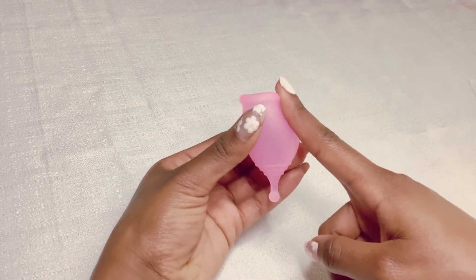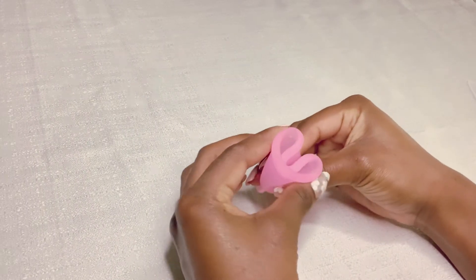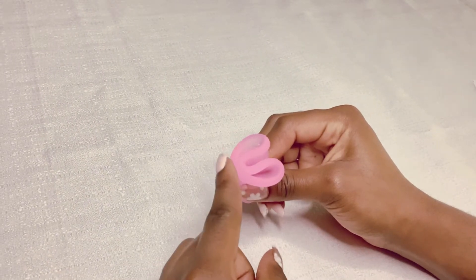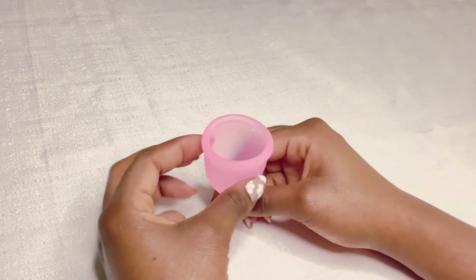So the first fold is the C-fold, also known as the U-fold. This is the most popular fold and works best if you're having trouble getting your cup to pop open. To do the C-fold, you take your finger and punch down and squeeze it together until you create a C-shape. You will want to insert this fold using the back of the C-shape or the bottom of the U-shape where it creates a curve. This fold is also great because you can do it with one hand as well.